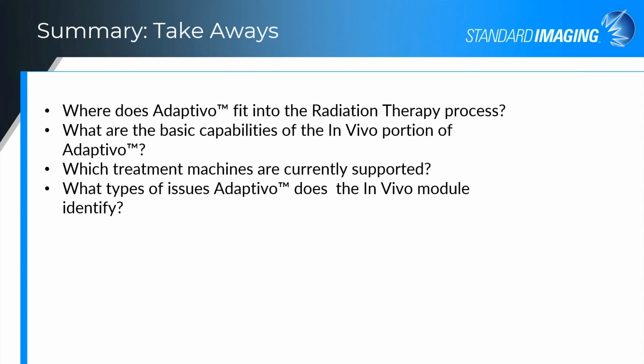And then work to bring the whole team into the program, because you'll find a lot of times that the therapists get a little apprehensive with packages like this being put on the machine, with the big brother aspect, but people that have used the tool find it to be quite the opposite. If you engage the therapists and get them used to looking at some of the results, you'll find that they take some of the information with the breast treatments into consultation with the physicist and physician. You can improve those setups.